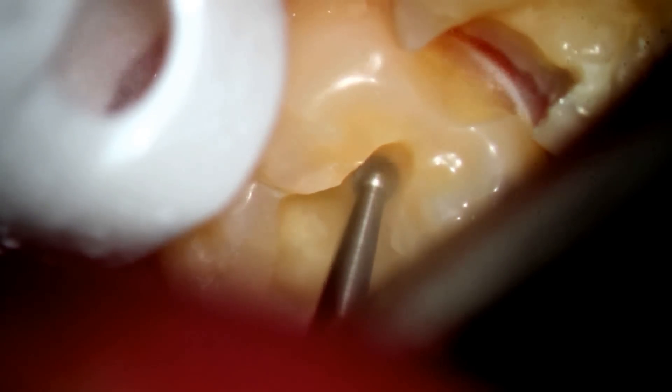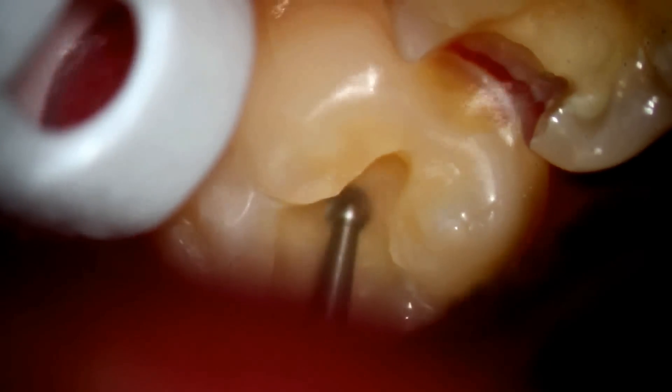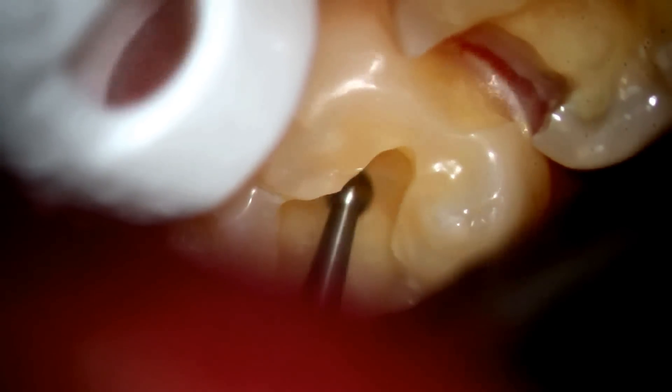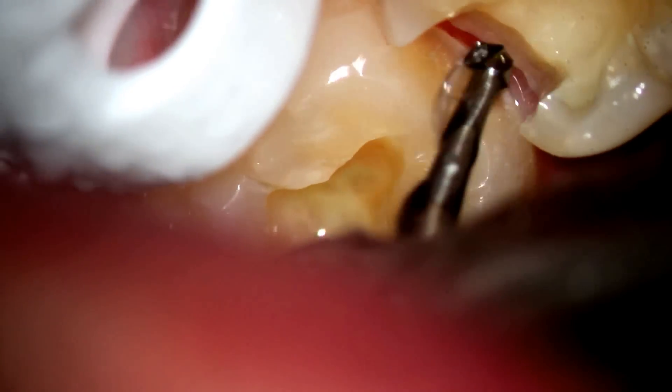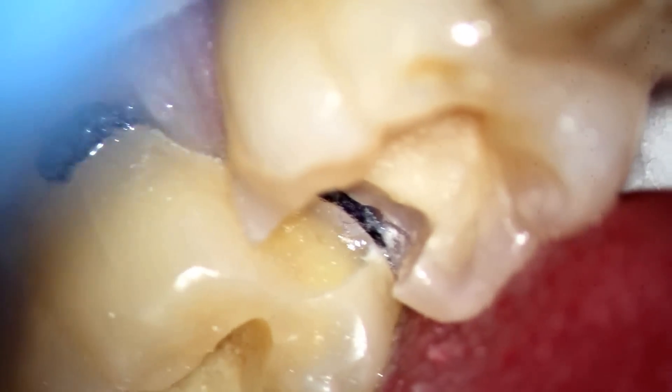There's still some decay, so we go ahead and remove that. This is relatively deep, so we're going to put some sort of base down — a liner — to help the nerve not be quite as stimulated and to make it more comfortable so that the tooth doesn't lose vitality. There's a little piece of cord packed between the teeth for isolation. I went back and removed any remaining white area. Here I'm putting the base in — that's for the second molar, then for the first — and we'll light cure that to make it nice and hard.